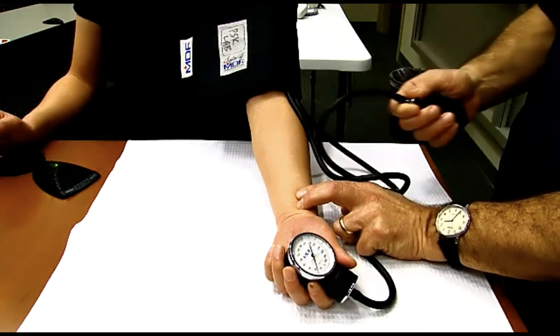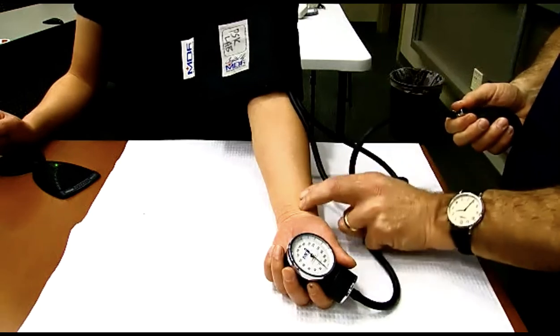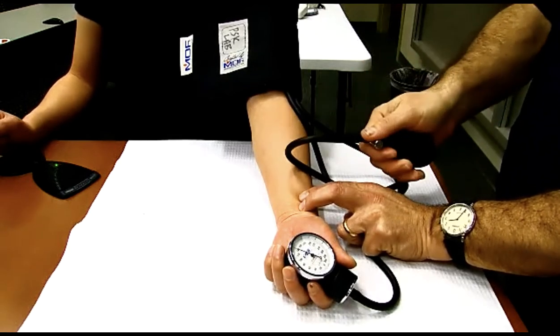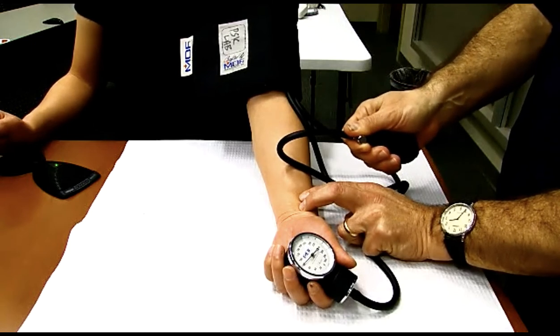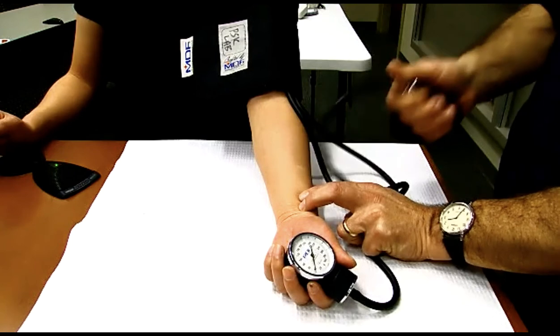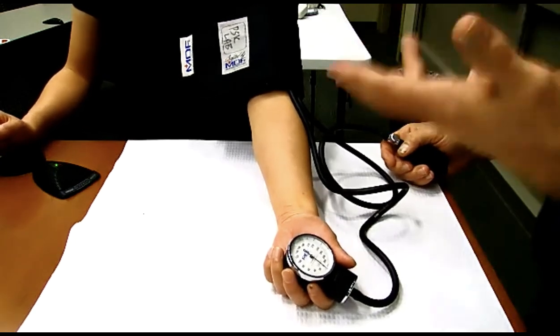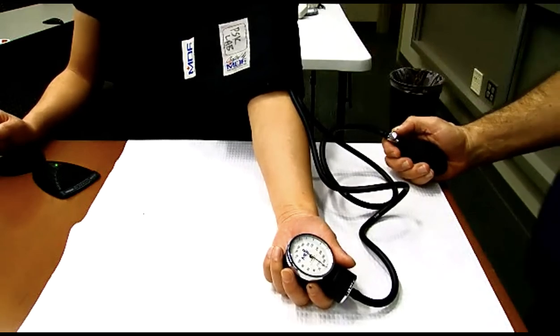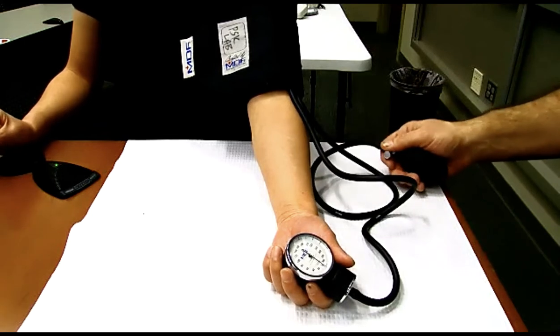So just as a quick reminder, to take an estimated systolic, you start with zero, you find the pulse, you pump and pump and pump until the pulse goes away, and then slowly release the pressure until the pulse comes back. The value at which the pulse comes back would be her estimated systolic. So for Aunt Judy, it came back at around about 94, I thought. So about 94 is what I estimate. So now I'm ready to take the pressure, but that's an estimate.